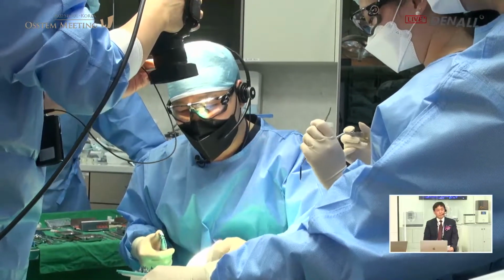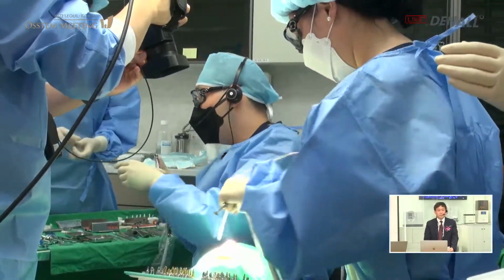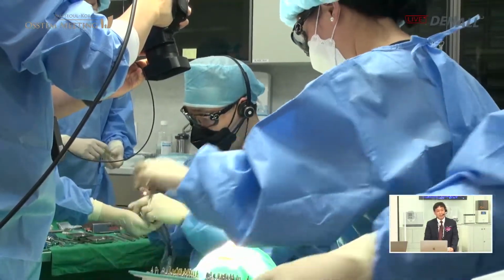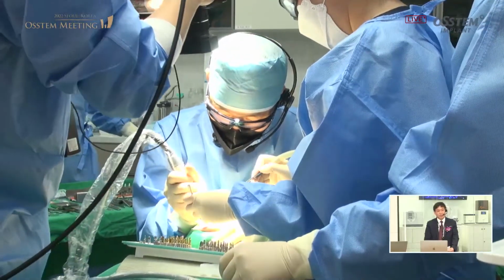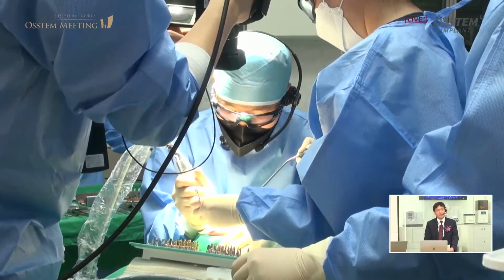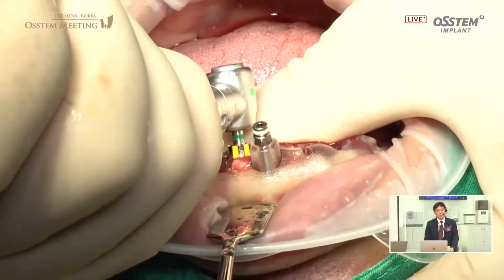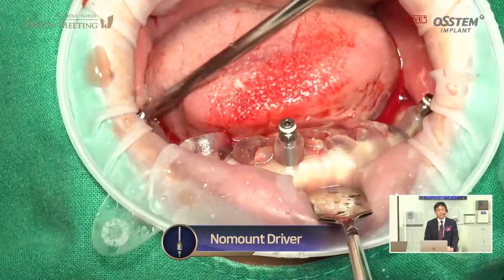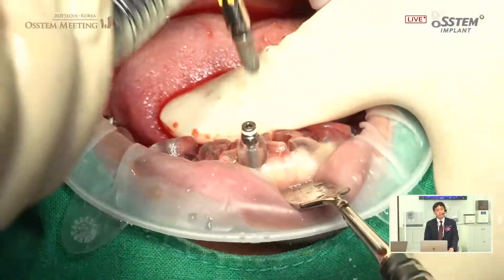Please relax a little bit. When you do live surgery, the assistant and the surgeon are important, but cooperation from the patient is very important. The patient is really very cooperative, so I'm able to show you what I've prepared.